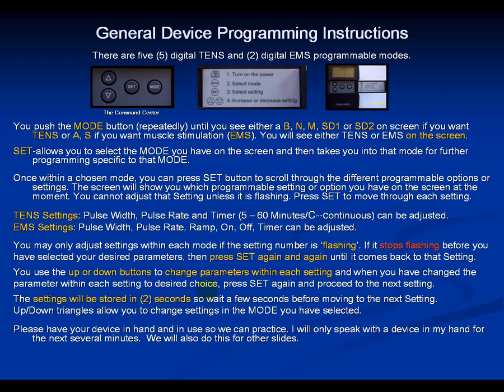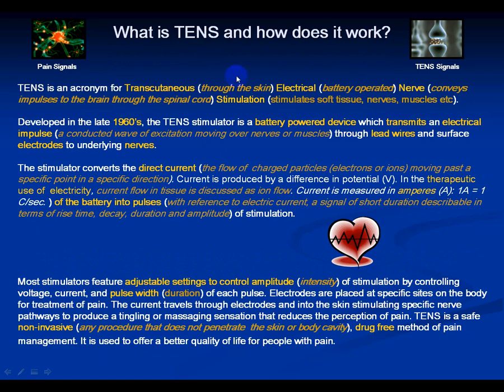Now you've got treatment going on your thigh and we'll discuss each parameter. What is TENS and how does it work? TENS stands for Transcutaneous — through the skin — Electrical, battery-operated Nerve Stimulation, which stimulates soft tissue, nerves, and muscles. Go ahead and pause this screen and read the rest of this slide for basic information on TENS.